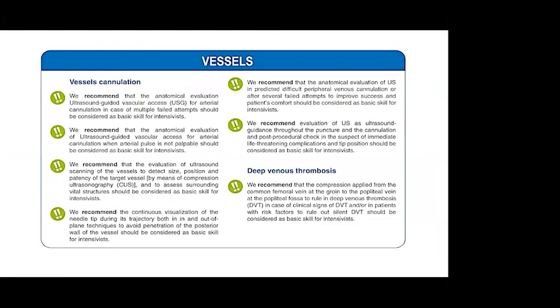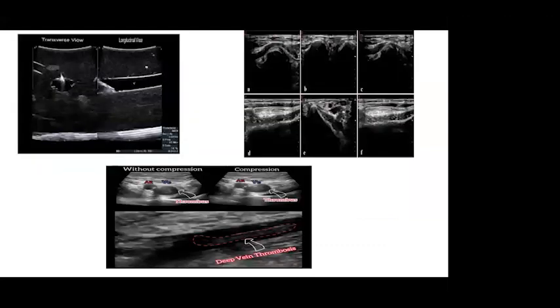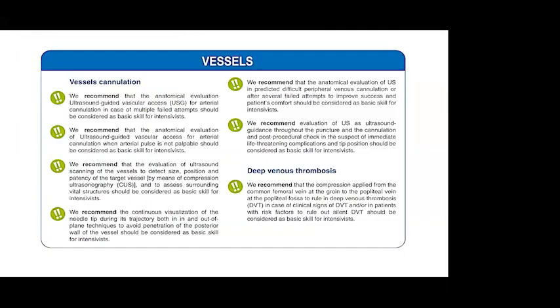Lastly, coming to the vessels, it is recommended that before you insert central lines, you assess the caliber of the vessel to rule out any obstruction or thrombus. You can do a compression study and see the length of the vessel which you can access. Always use ultrasound guidance, not an assisted approach, meaning you need to always track the needle, whether you are using the longitudinal approach or a transverse out of plane approach. It's also recommended that if you have a difficult or failed arterial cannulation, you can use ultrasound for arterial cannulation as well.